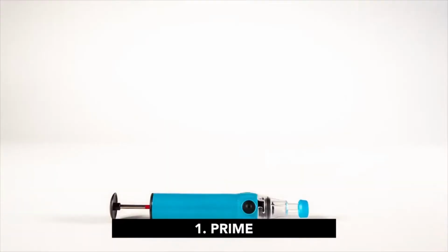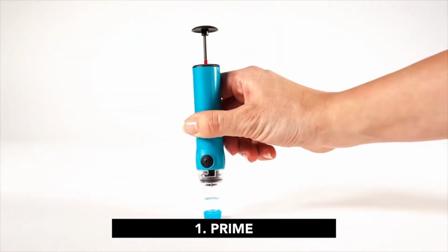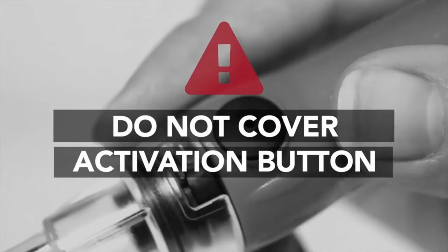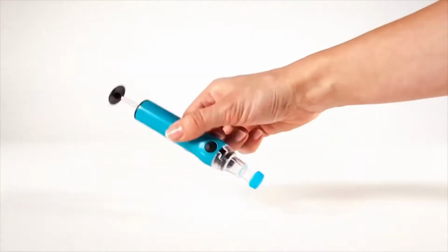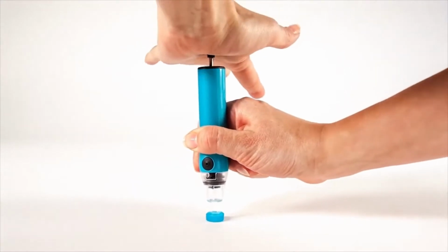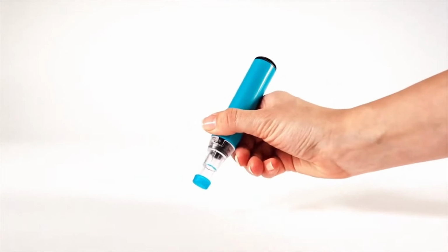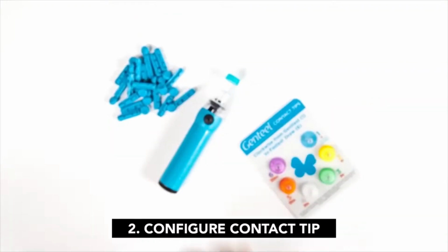First, you need to prime Genteel by holding the device with the nozzle facing down. Make sure that your finger or hand is not covering the activation button. Now, push the plunger all the way in until you hear and feel a click and the plunger stays in place. Genteel arrives with the shallowest contact tip factory installed.